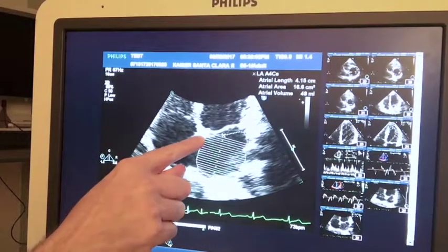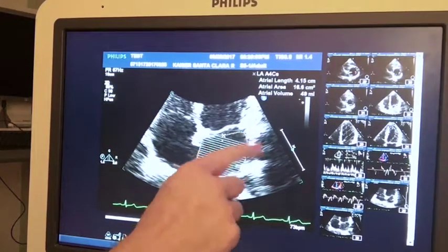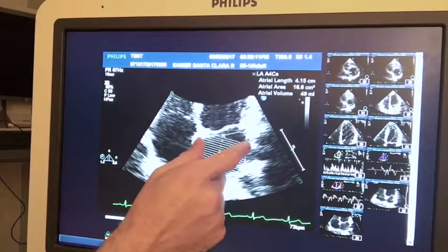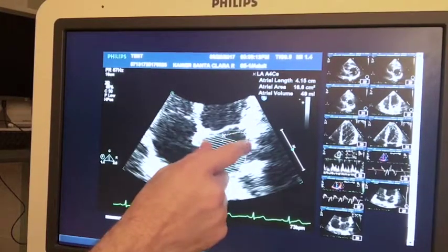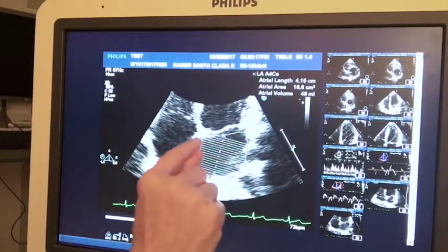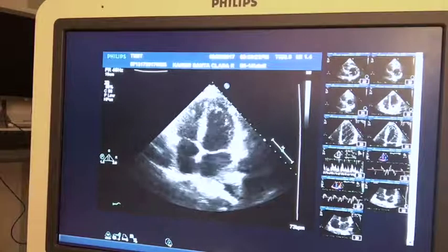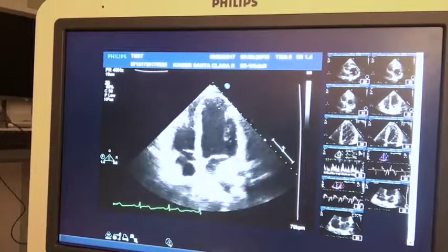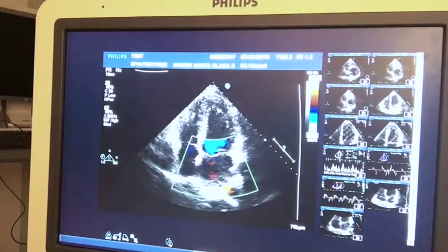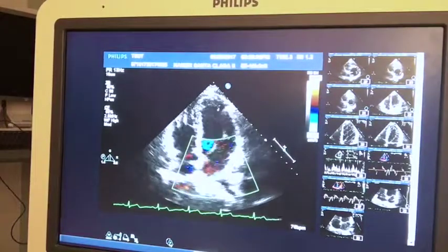I'm going to show that it's going from the annulus of the mitral valve to the other annulus on the other side of the mitral valve, and I'm basically cutting off that mushroom cap. I'm cutting off the top of the mushroom so that I only am seeing the stalk. Okay, only seeing the atrial space that is really atrial, versus some large dome that was created from the mitral valve during its full space, just prior to diastole.